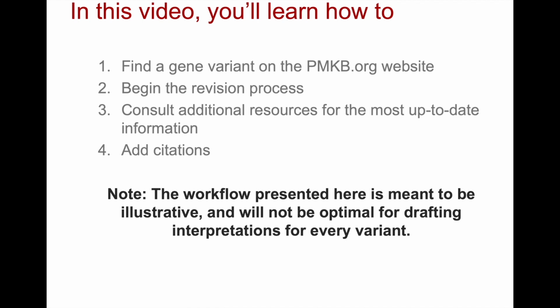Before we get started, I just want to say that the workflow presented here is meant to be illustrative of how to use external databases to acquire information that can be used in the interpretations that you write. It won't be the same for every variant, and you may find that you develop your own workflow that works better for you. Okay, with that being said, we can get started.